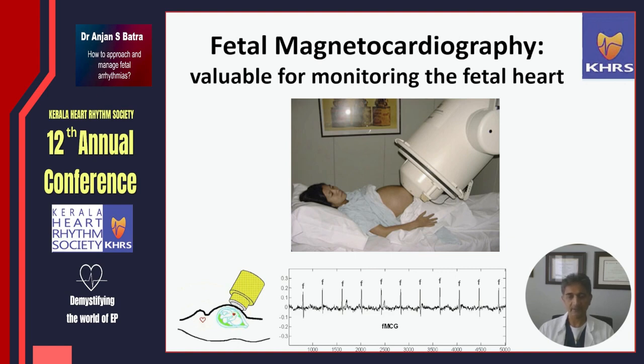If we are worried about long QT in the baby and need to measure QT intervals, then this tool could come in handy. But again, I will emphasize at the current moment, this is a very expensive, very bulky, and very limited tool that is available and that we can just all be aware of.